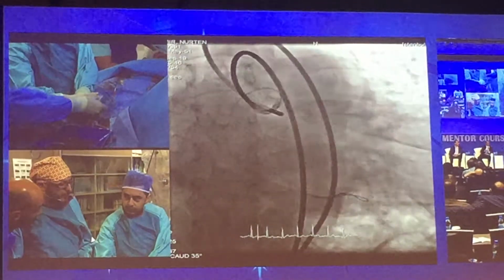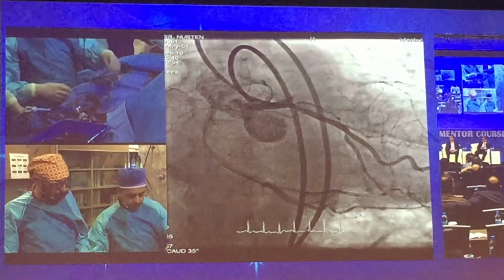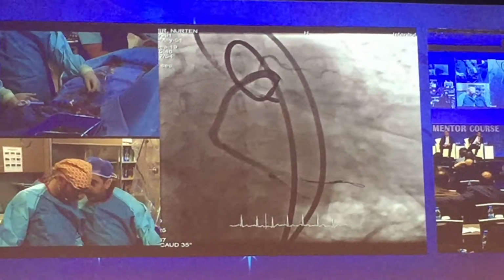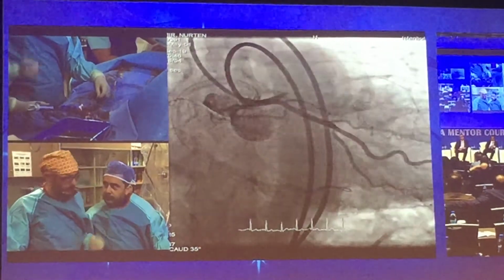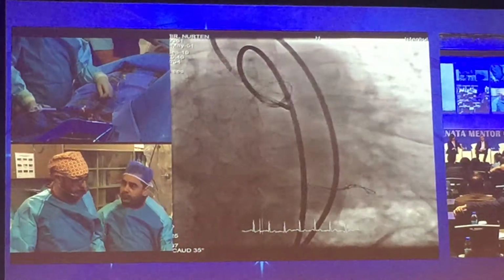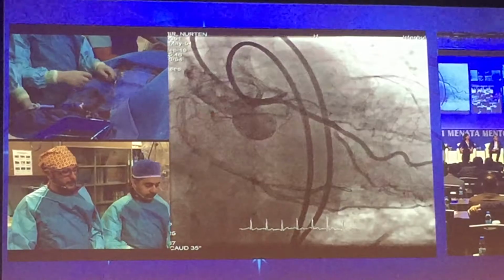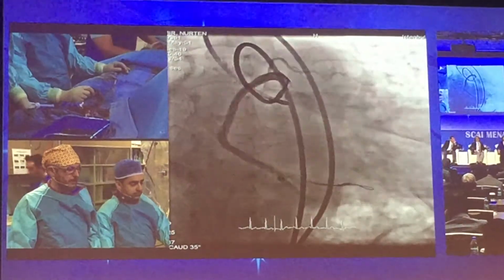Any comments? Okay, Sabriye, what do you think? Nothing will happen, okay, we will wait, no problem. We won't look again. We won't look until the end. You are going there. It is an in-stent restenosis. Does it differ? What do you think about this? In terms of starting the wire, does it?